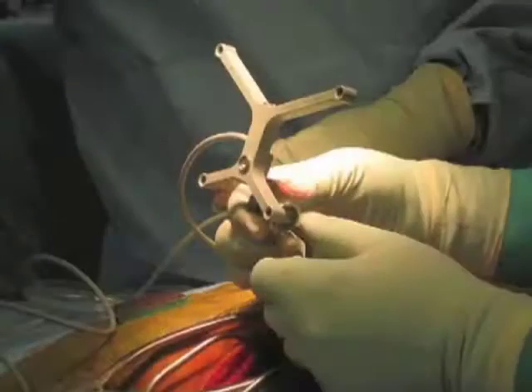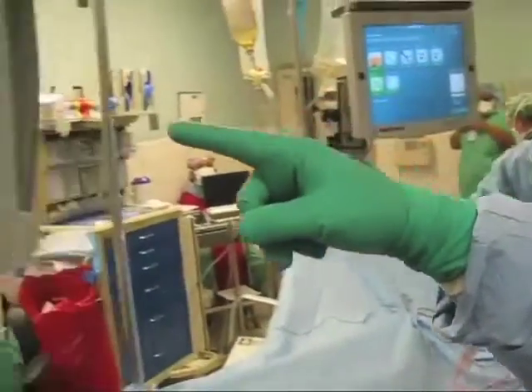Before we capture the image, we have to have a marker on the patient. So we attach this small device through this post. There's a pin that is placed inside a bony landmark. So for the pelvis or the spine, it would be the posterior pelvis where, right about at your belt level, you can kind of feel that bone there. So we put a pin into that bone and attach this frame to that pin. So when the machine spins, it knows where these reflector balls are, and then the computer knows where all of the bony anatomy is, where the skeleton is, in reference to these four balls.